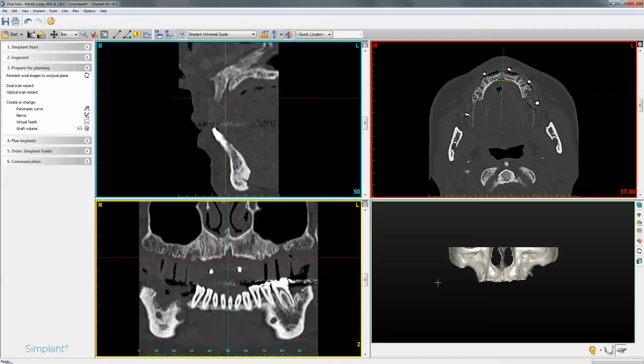Please do not remove the beads. The beads need to be present in both CBCT files scanned. Once the scanning procedure is complete, you would open Simplant and open the patient scan first.